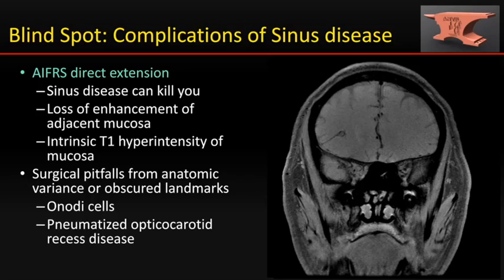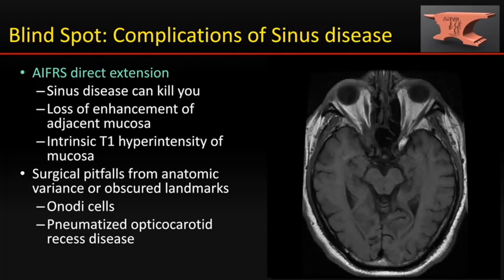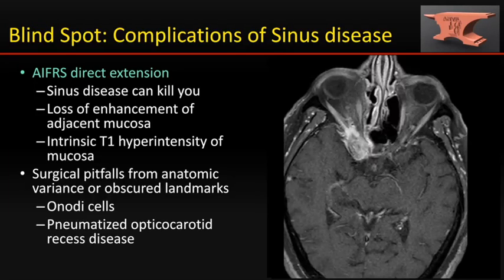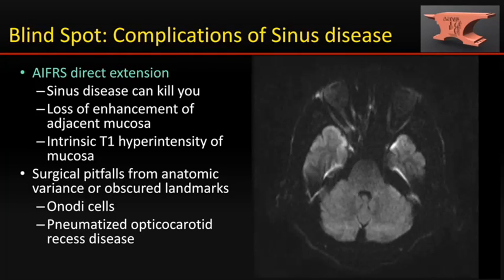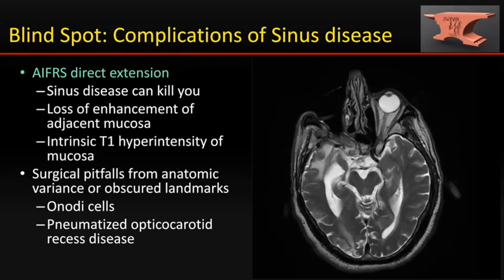Here we see inflammatory stranding at the orbital apex, and this was intrinsically T1 bright. Notice there was some adjacent sinus disease, and notice there is enhancement and inflammation related to this severe invasive fungal sinusitis. It got progressive. You can see extensions to the maxillary sinus. Here's diffusion restriction within the optic nerve, and this led to exenteration and evisceration of the orbit to remove that devascularized tissue.